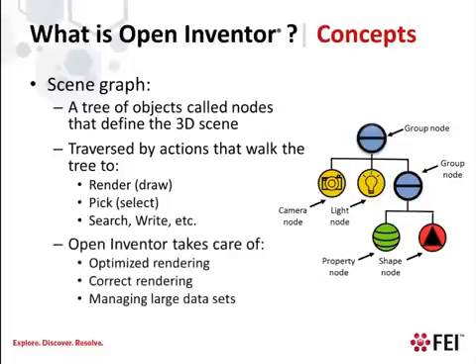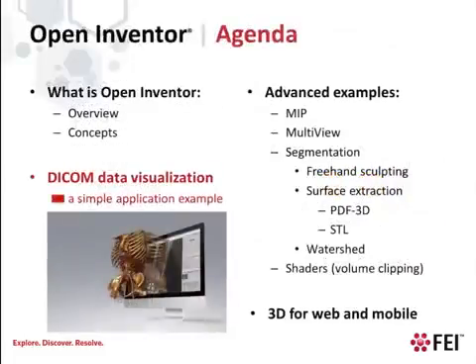to each shape. In summary, your application will be responsible for defining the appearance and the meaning of the 3D objects in the scene. This is the most important part, where you use your domain-specific knowledge to create value for your customers. Open Inventor will be responsible for rendering an image of those objects, maximizing performance and image quality, and ensuring that complex scenes are rendered correctly. Next, we'll look at some data management concepts for volume data, and then a simple medical rendering program built using Open Inventor.